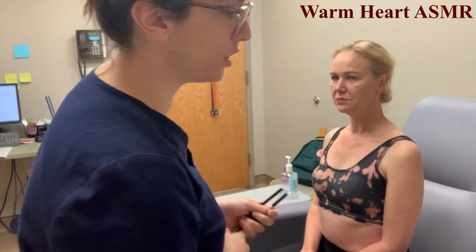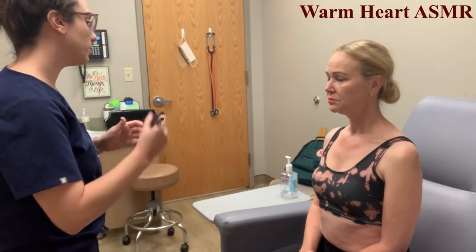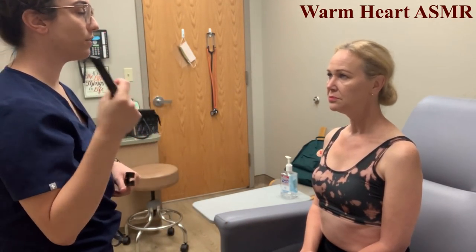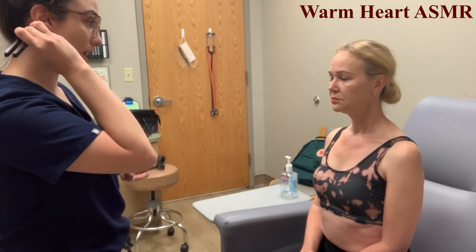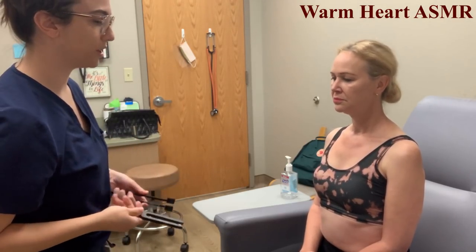Next we're going to move on to hearing acuity. We're going to do the Rinne test first, which requires a tuning fork. I'm going to strike this and place it behind your ear on the mastoid bone to test bone conduction, and then move it to the front when you're unable to hear that ringing vibration to test for air conduction. Tell me when you're no longer able to hear the ringing.